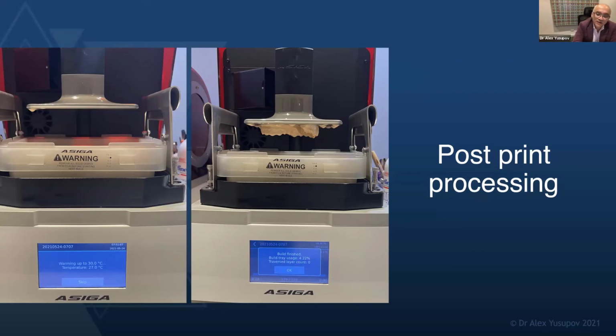And what I love about a Asiga printer is it actually tells you how much use your tray has had. So if your tray has reached more than 100% of its use, it will not allow you to print anymore, which means you always have high quality prints, because if you don't have that measurable or visible, you keep using the same tray, even though the optical quality of that tray has degraded and your print quality has degraded.